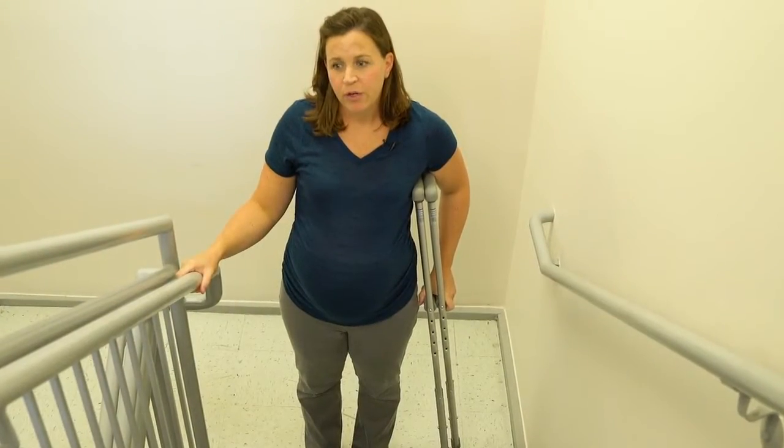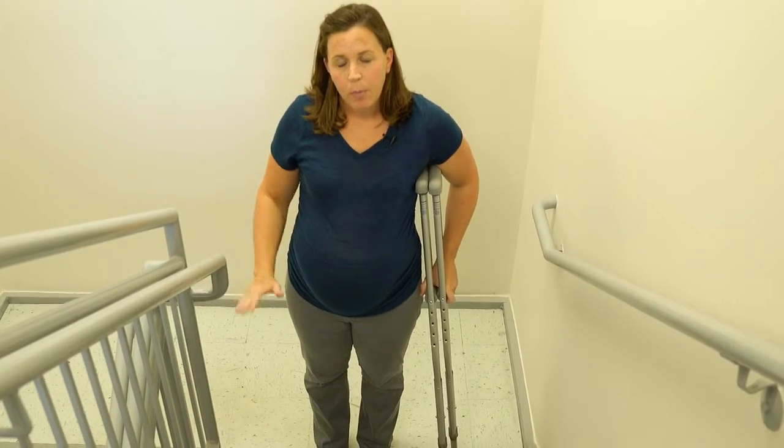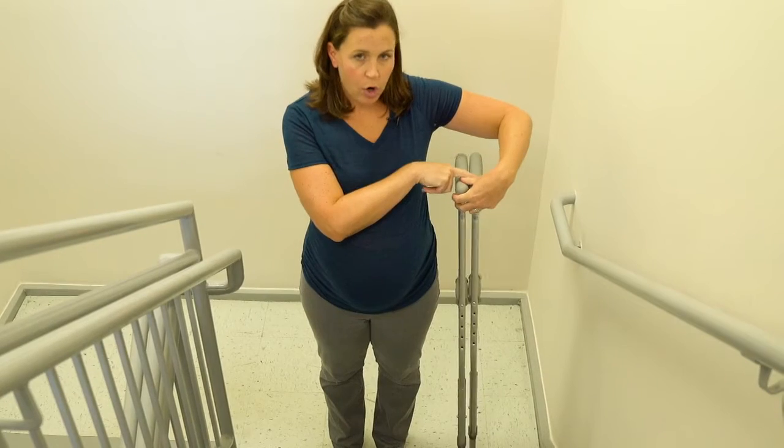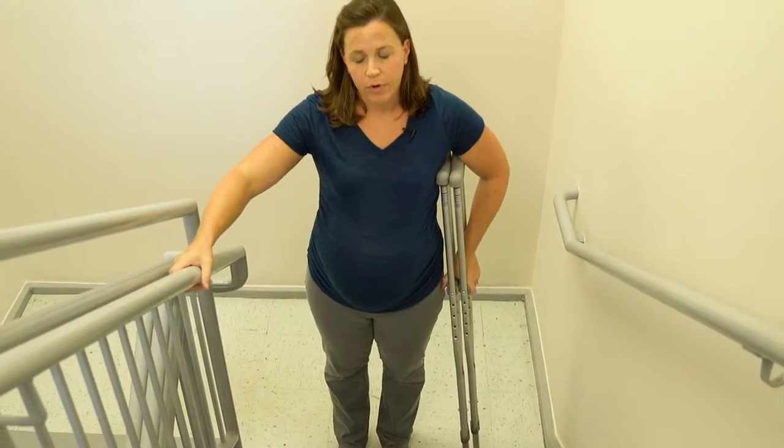If you have a railing on your stairs, I recommend using it. You're still going to step up with your good or unaffected leg. You just now are going to put your hand on the railing. You can move your other crutch over to the other side or have somebody else hold it for you.